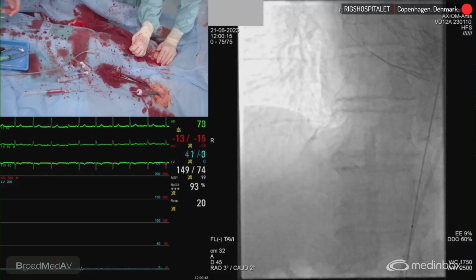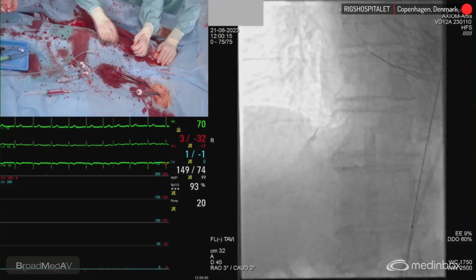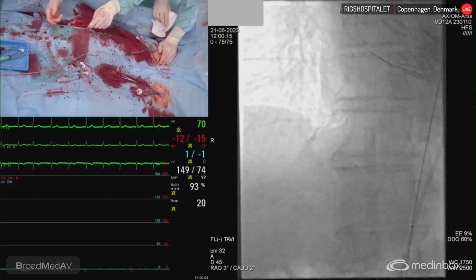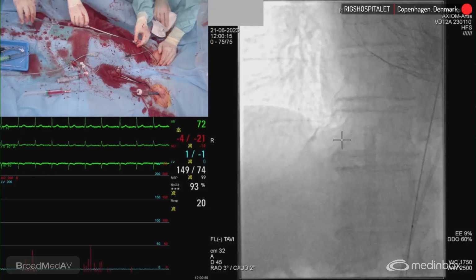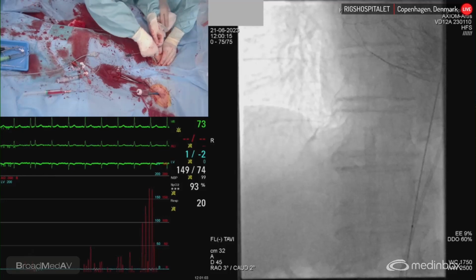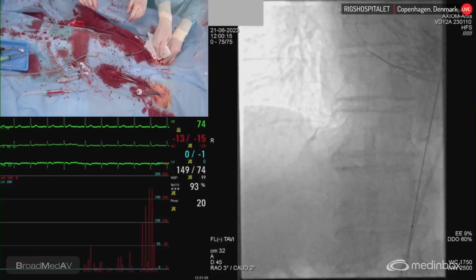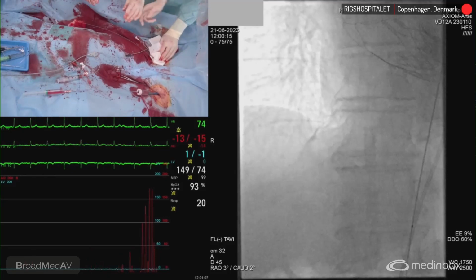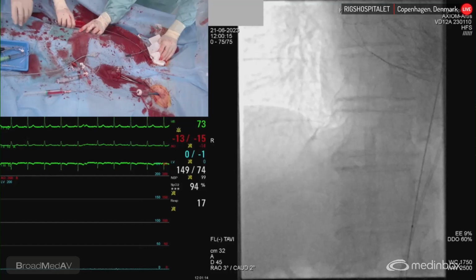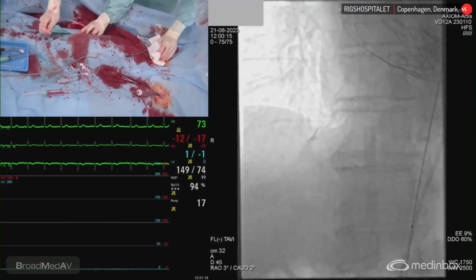Can I have a dry serviette, please? You just get this thing in. That's good. Compress around it. Now you can just focus on closing. You know what I would do, you have the safety wire. So take the safety wire out, clean it, and we cross over with the 8 Arrow. Yes, good old style, like we do the crossover with the 8 Arrow.